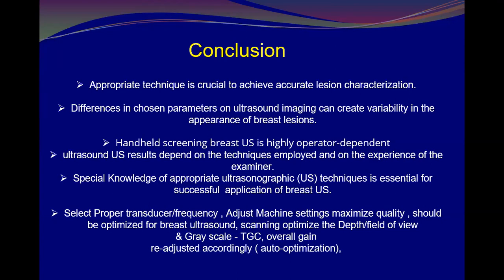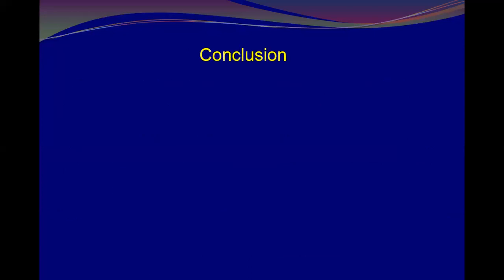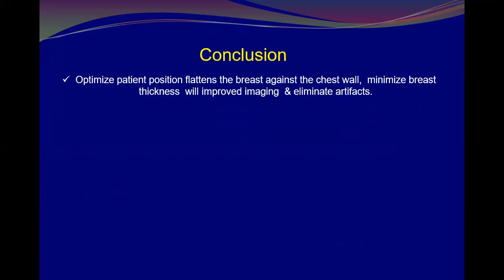In case of identifying lesions, we have to readjust accordingly, unless we have a machine with auto optimization.